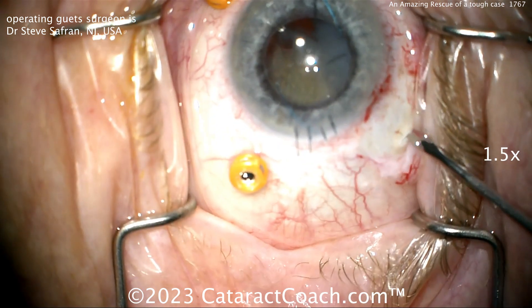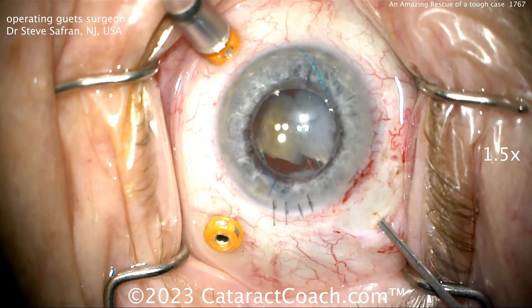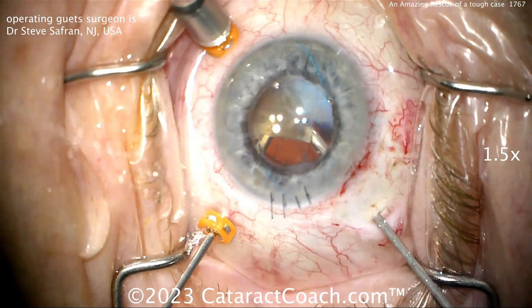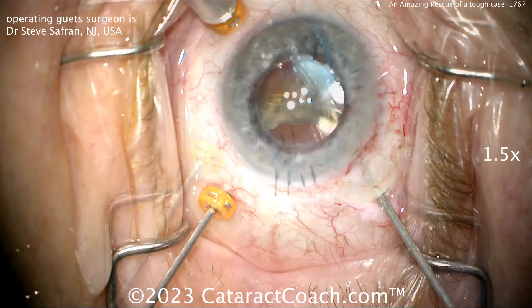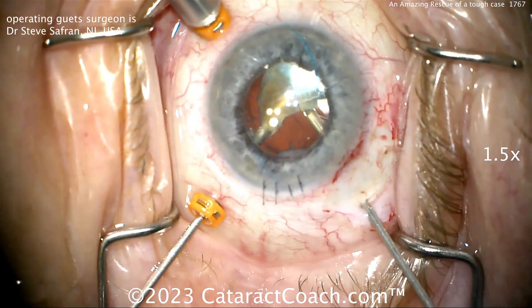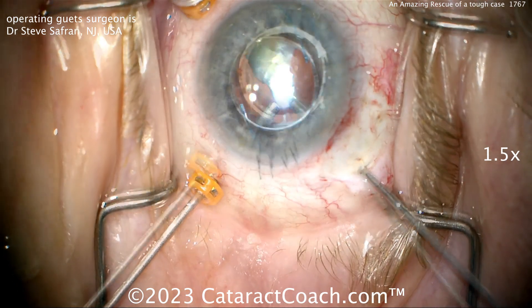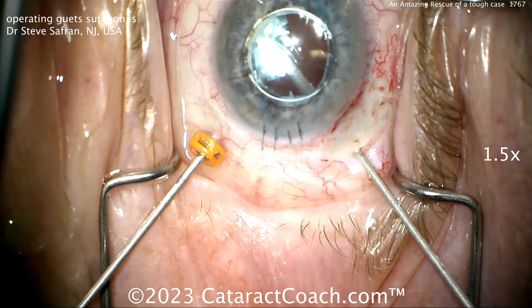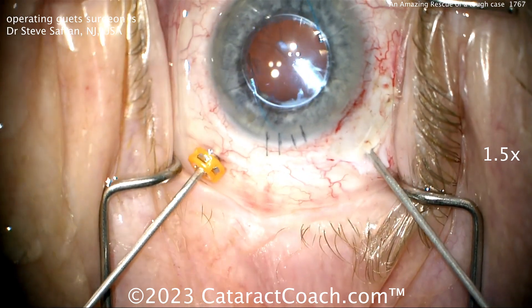Going in with a vitrector here. Notice how the sclerotomy is a little bit wider, so we can use a phacofragmatome if needed, which is a wider instrument that doesn't fit through the trocar. We sped the video up a little bit, but you can see wolfing down that remaining lens material using the vitrector, pushing it up against the optic of the IOL to help mush it down the port of the vitrector.